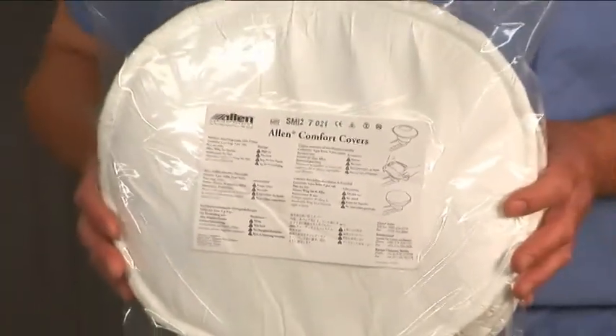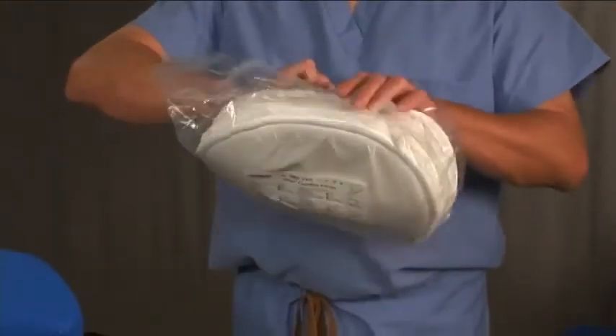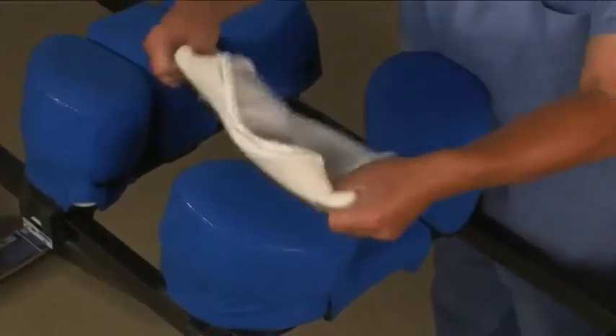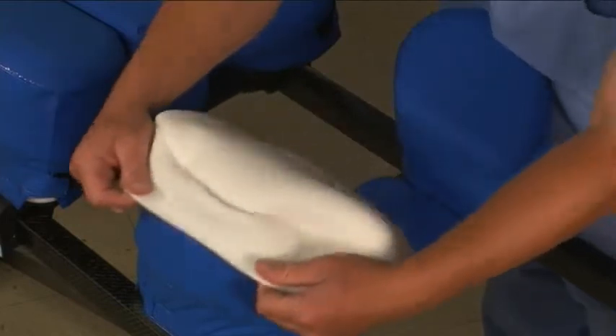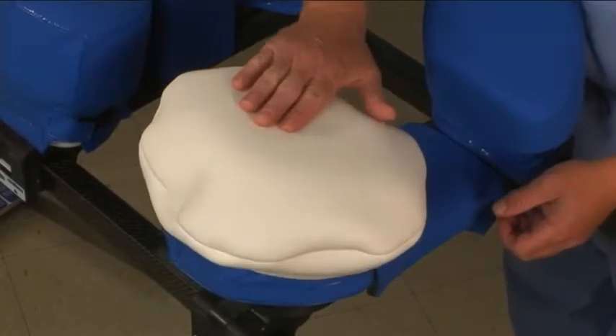The Wingsets should always be used with a covering. The Allen Comfort covers were specifically designed for this purpose. They are single-use covers made from latex-free polyurethane foam. Turn the covers inside out so that the patient will contact the foam material. The covers should slide freely — this helps to reduce shear on the patient's skin.